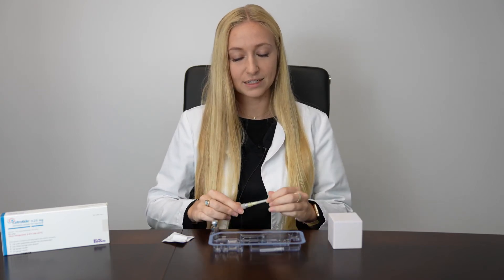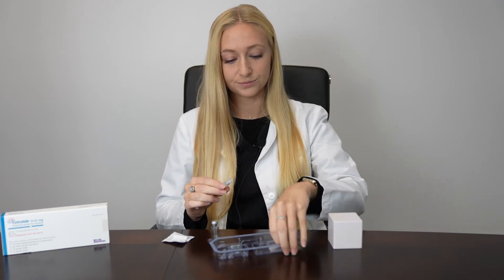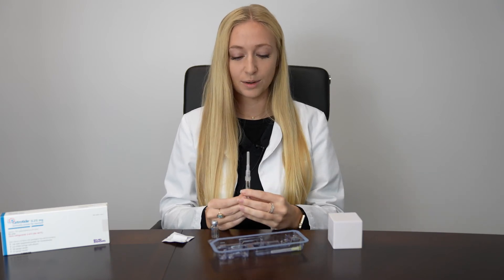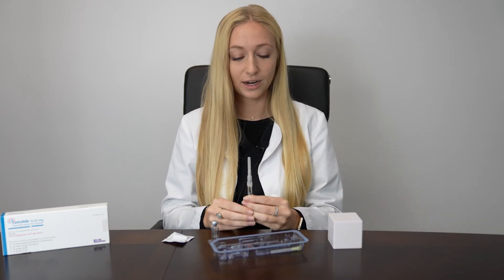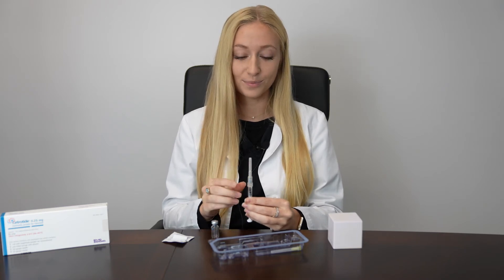Carefully recap your mixing needle and exchange it for your injection needle. With your syringe facing upward, gently tap the side to expel air bubbles and push up on the plunger until you see your little bubble of liquid at the top — that's how you know you don't have any more air in your syringe.